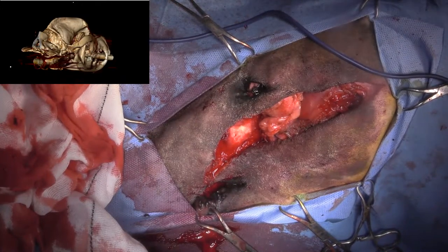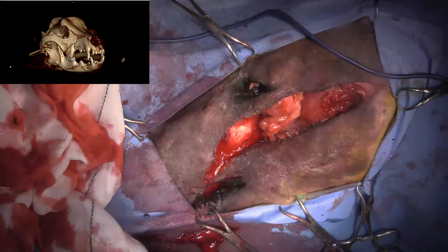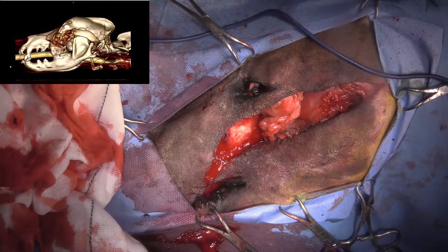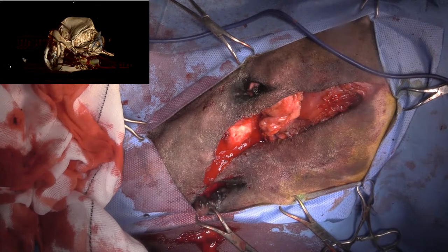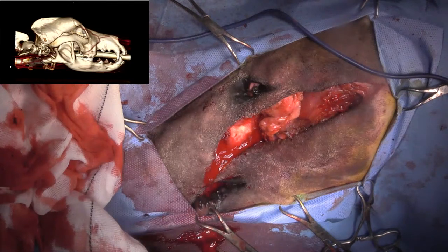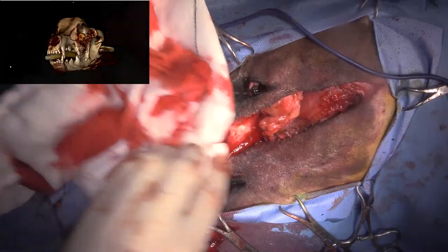Great. Okay, so I'm just going to come over and make sure that we've answered all our questions. You're totally okay, Jeff? Yep. And then we'll go through a plan. I am going to leave the hemostatic sponge in the wound because that'll help create a seal to the nasal cavity. Right, so that's pretty much it. I'll just let you keep watching Jeff for a little bit while I do the plan.